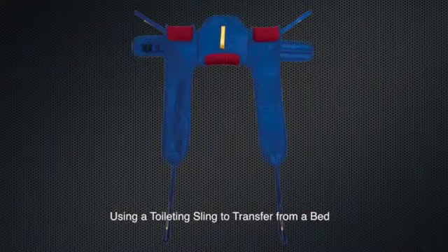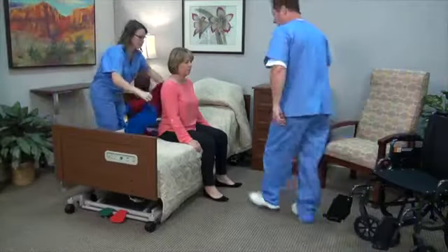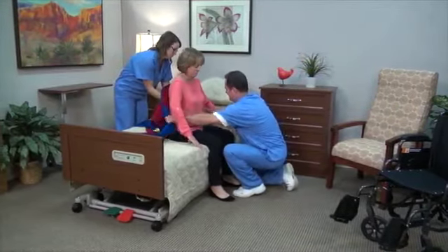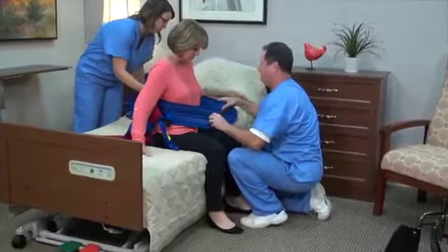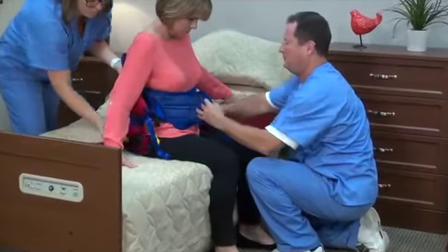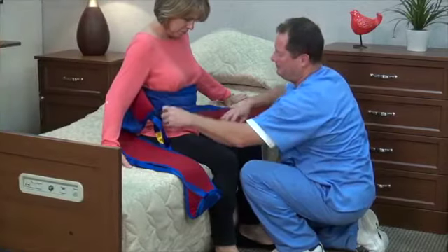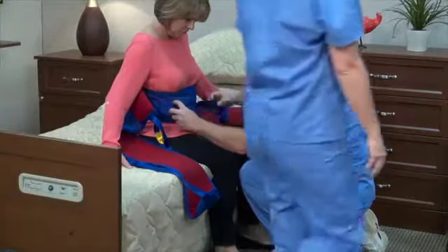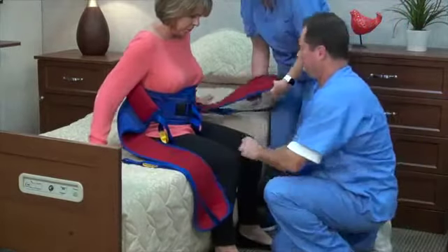Using a toileting sling to transfer from a bed: the toileting sling provides additional security and is ideal for use with a sit-to-stand lift. Position the sling behind the back with the two red pads under the arms and the single red lumbar pad against the small of the back. Make sure the adjustment strap is on the outside. Cross the chest belt over the chest and secure using the buckle, adjusting for comfort as required.